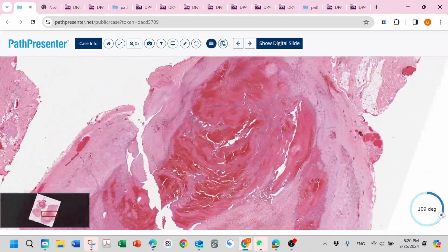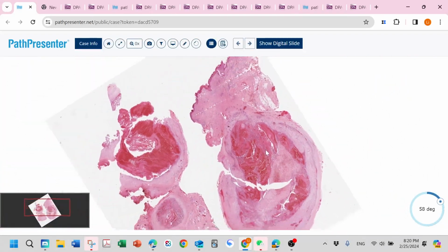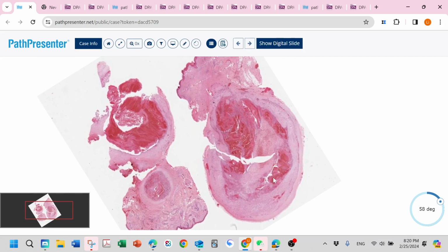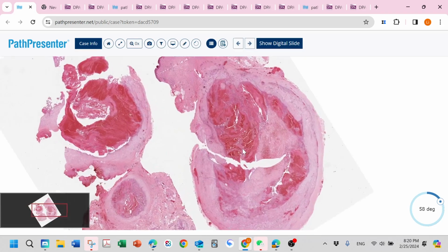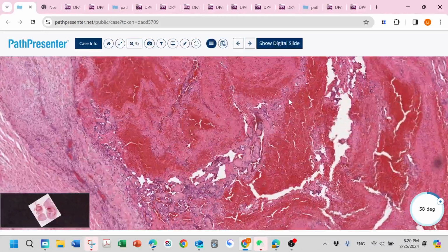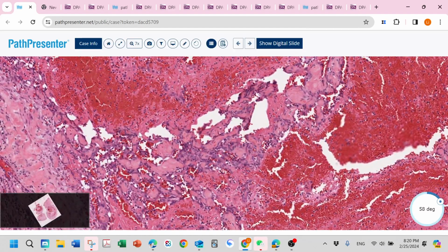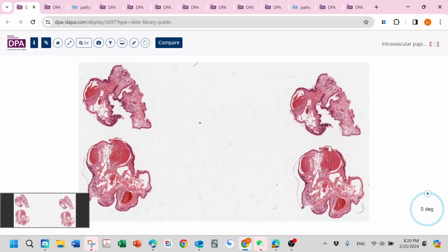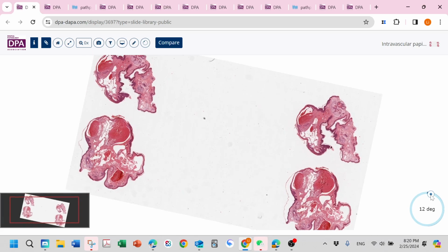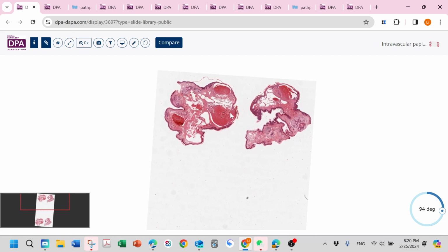For this one also the same, really big vessel, just gets a big thrombus, this fibrin deposition. Then these endothelial cells just try to grow inside to dissect this big thrombus and form this papillary structure. This is another Masson tumor, papillary endothelial hyperplasia.